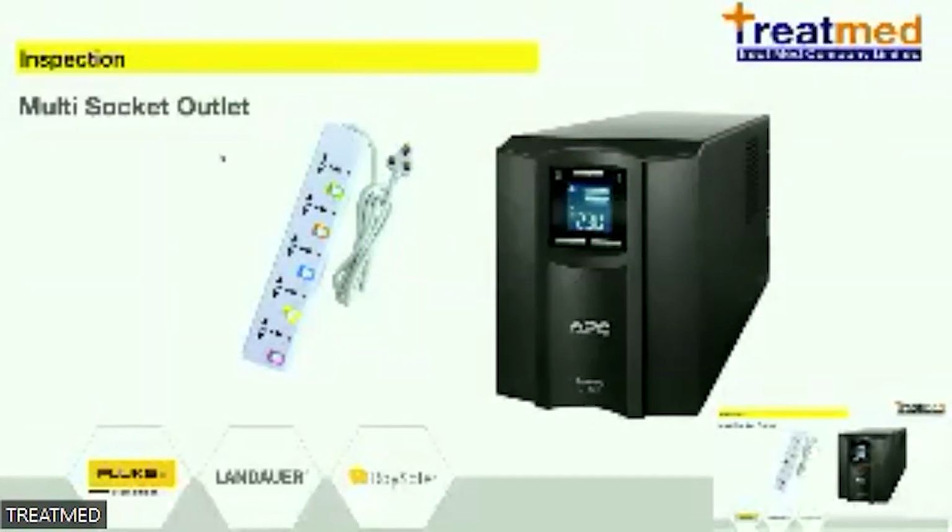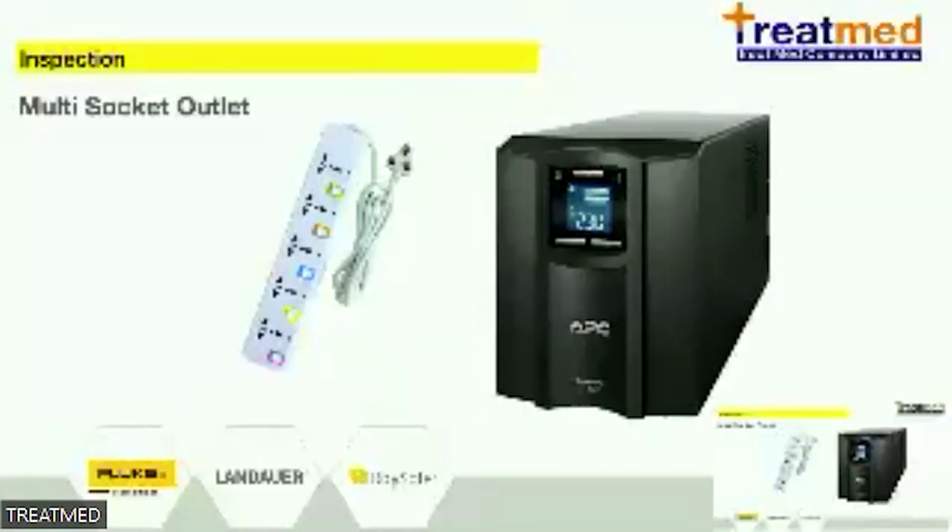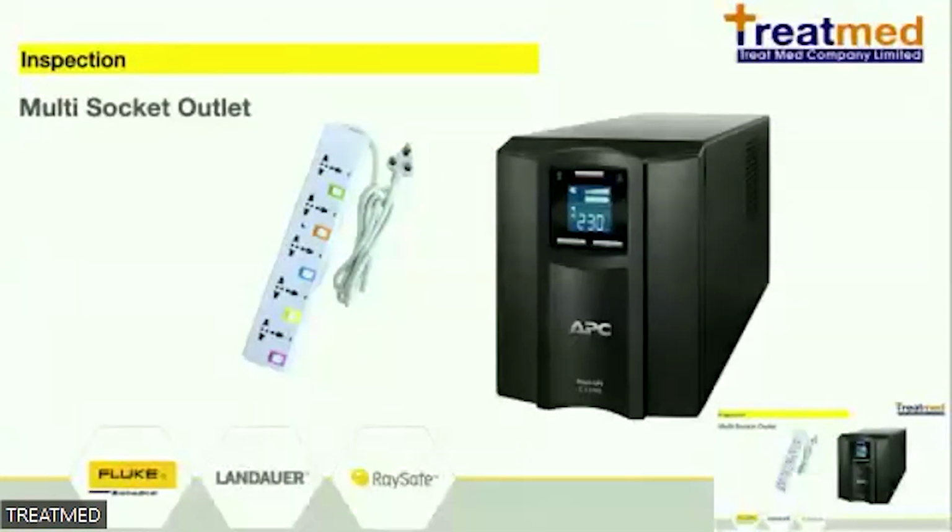So this is the multi-socket outlet. In IEC 60601, we call this the multi-socket outlet. This is an extension cord. This is a UPS power supply. Normally in Thailand they use an extension cord to extend the range of the power cord. We recommend a good ground and a good power cord, because an extension cord is not standard. It can damage the medical device.